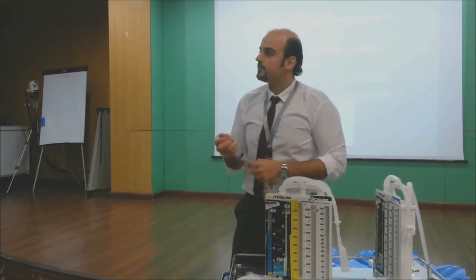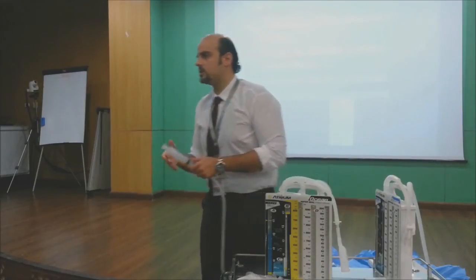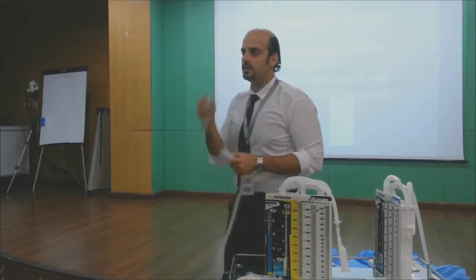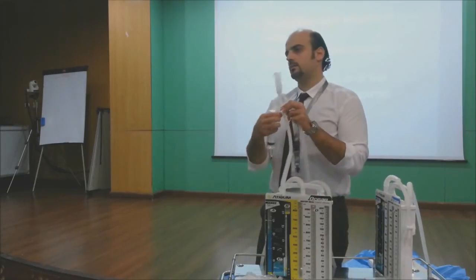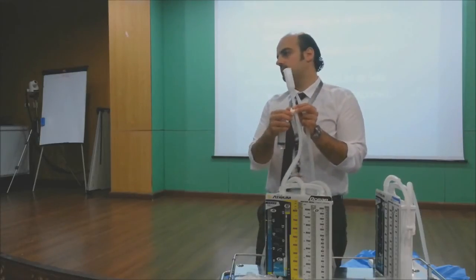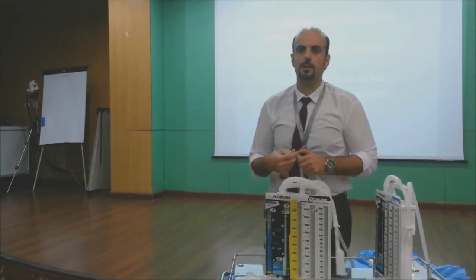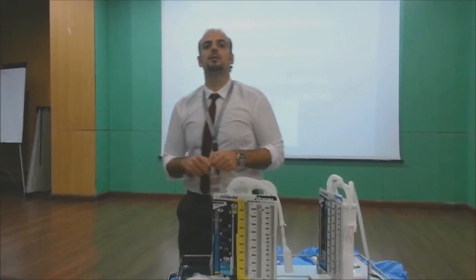So how much pressure will they keep? The wall suction, you know, is not accurate, right? It's different. Every single room has a different wall suction. So by my eyes, I can adjust this. Here. Apply negative suction at your wall and adjust it from here. Just adjust it to see a bubble come. A few little bubbles, that means khalas. It's working.